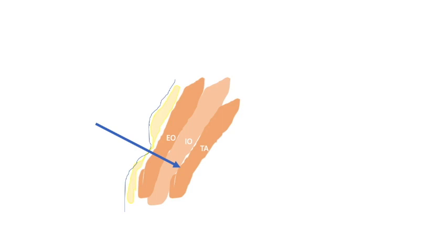So with the first bounce and pop, you pierce the internal oblique fascia, and with the second pop, you are below the transverse abdominis muscle. So you are in the wrong plane. When you inject the drug here, your block will not act. So you are in the wrong plane.